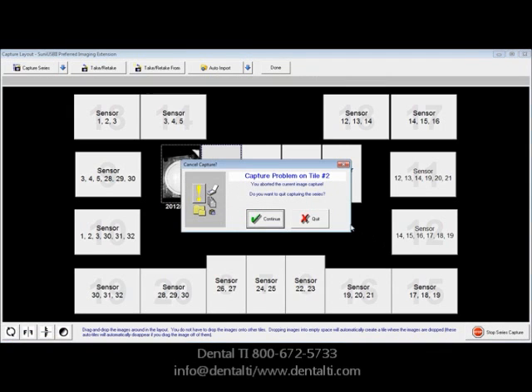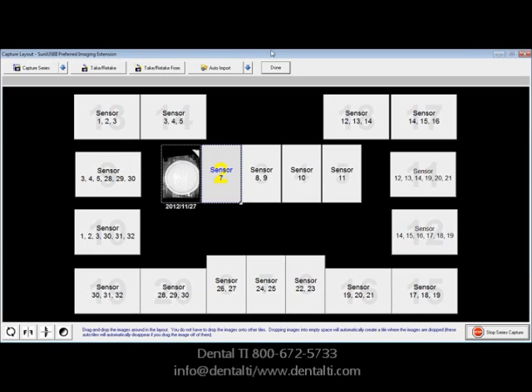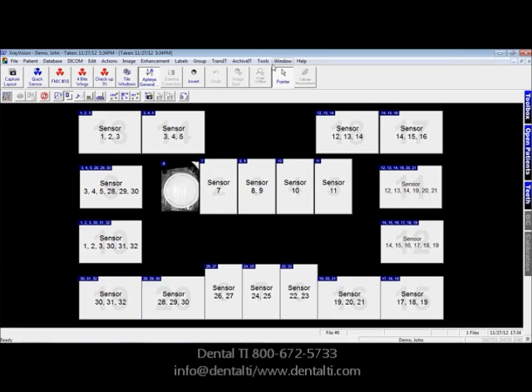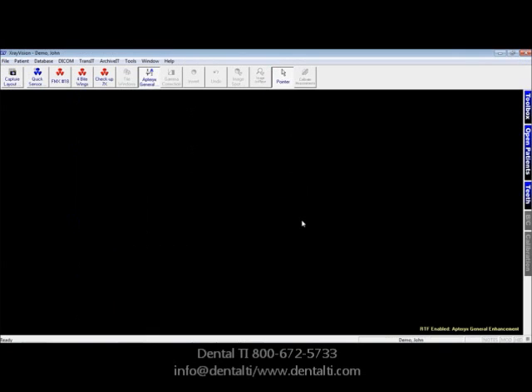It says you have aborted — do you want to quit capturing the series? Click Quit, then click Done. That's how easy it is to take full mouth series, bite wing series, or any checkup series that you want in a layout, put as a shortcut on the toolbar of X-Ray Vision.